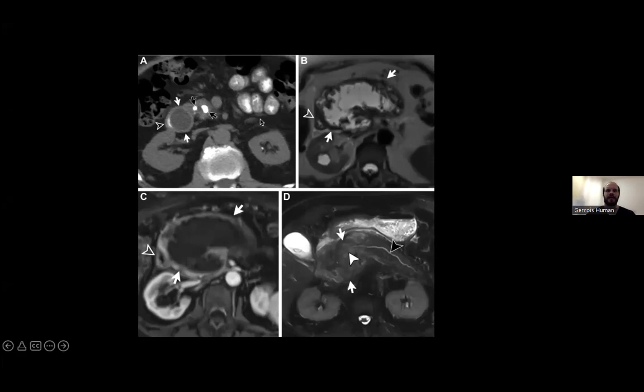And then this is a different patient, which has a Walled-off necrosis, so quite a severe collection in this groove region. And again, we can see the duodenum being quite effaced and small. This was just the T1 imaging of that similar patient, showing the collection and the thick irregular wall of this Walled-off necrosis.